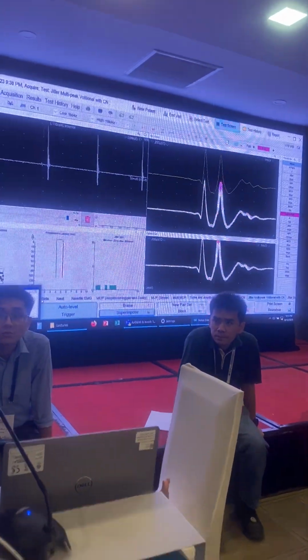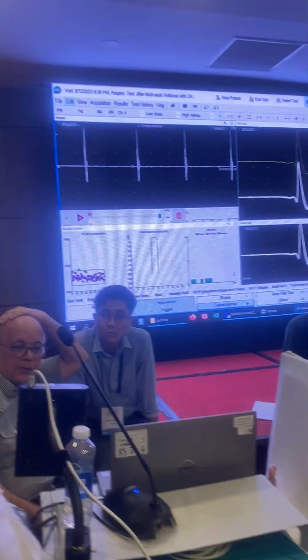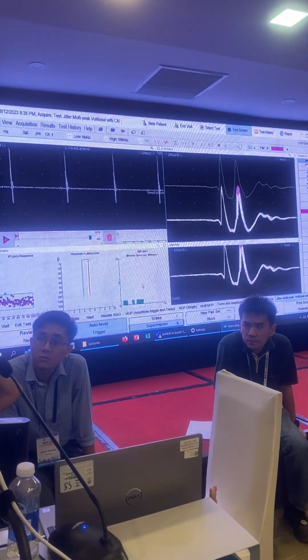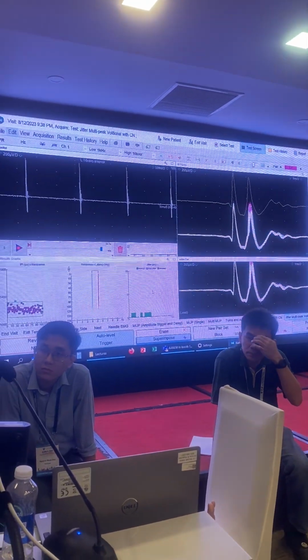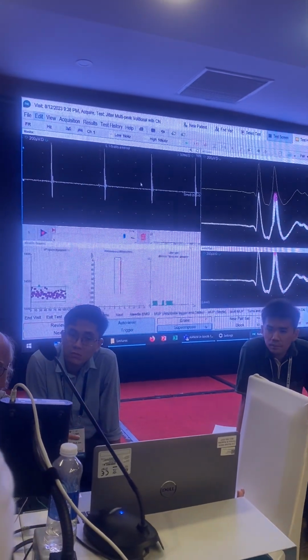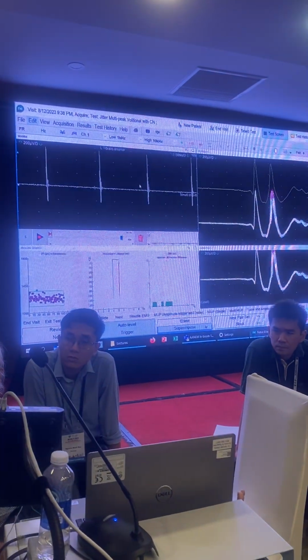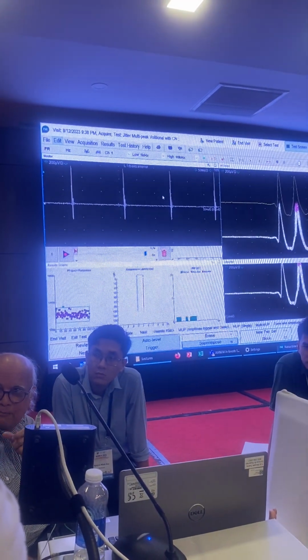Yes. So this machine has the peak detection technique. Yes. That's how we change from a peak detection. Yeah, you saw that function key at the bottom right in the previous program. Yeah. This is peak only. This program is peak only. The first program that I showed allows you to go level or peak. Yeah, okay.